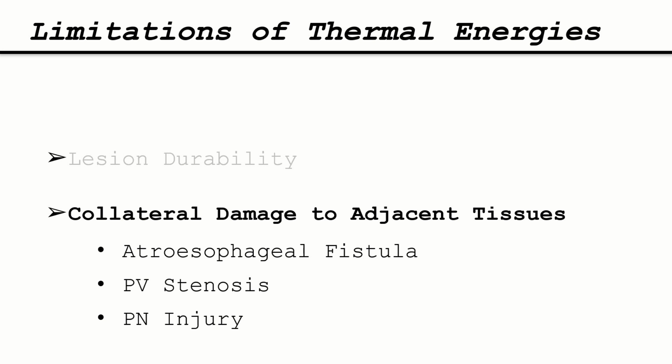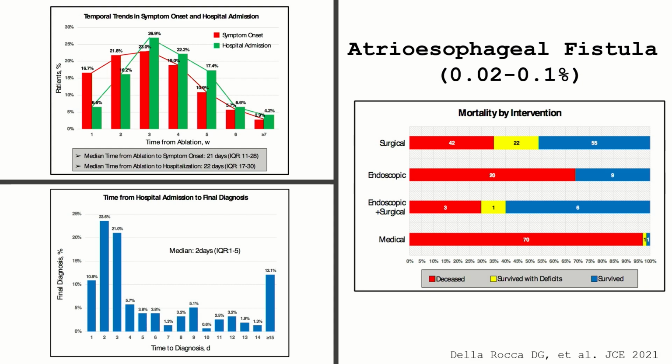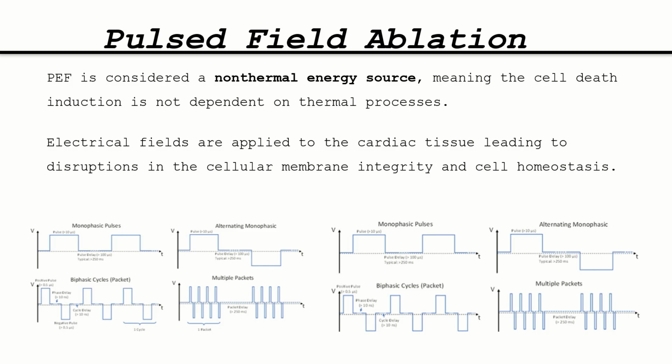Although phrenic nerve injury is often transitory, I can assure you, coming from a big cryoballoon lab, that it happens occasionally that these patients still persist and they're extremely impaired by this complication. Just a slide on atrioesophageal fistula. So this is why, at least in our lab, but I was asked to give an opinion also based obviously on literature, pulse field ablation is coming in as a huge horse all around the world, and certainly in European labs it's been increasingly used because it's safe and it offers extremely good results.